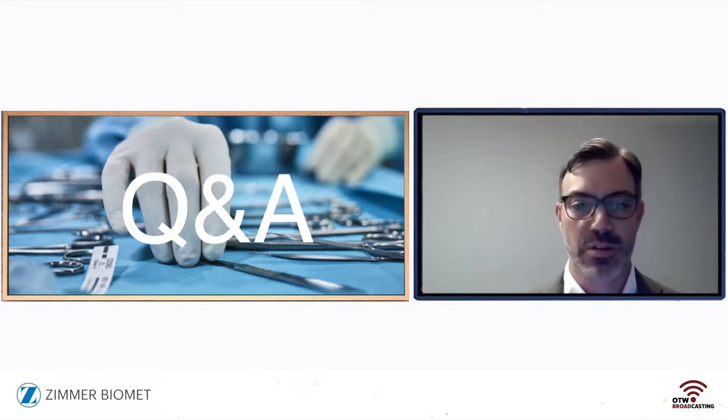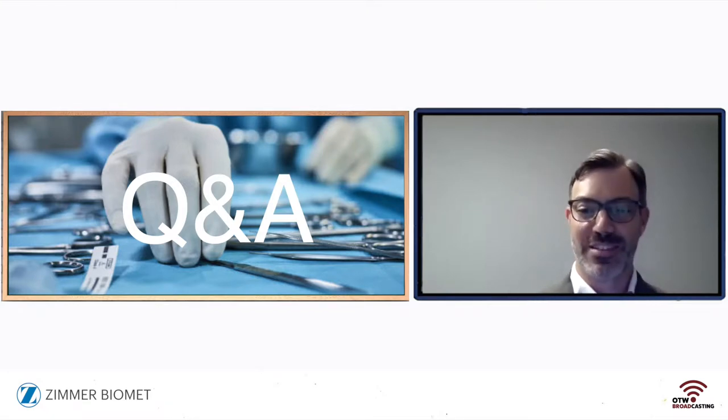And it's important to talk to the patients. When I have the preoperative discussions, the fusion always comes up because that's the gold standard in what we're comparing things to. And quite frankly, we have a lot more power for cosmetic correction with fusion than we do with VBT. So if that's important to patients, they need to understand that and know. And I've had some select out of it for that reason. So I think that's, in a nutshell, how I would define success for these patients.